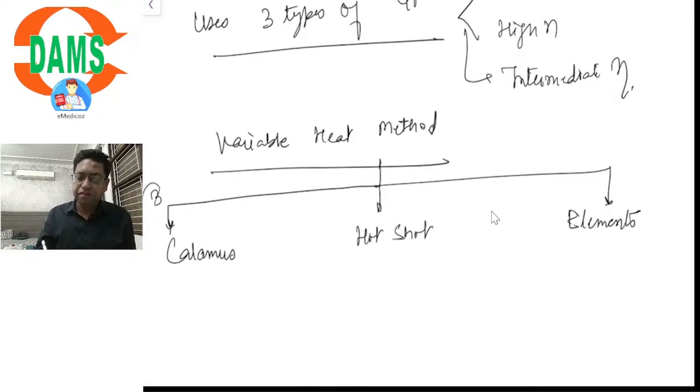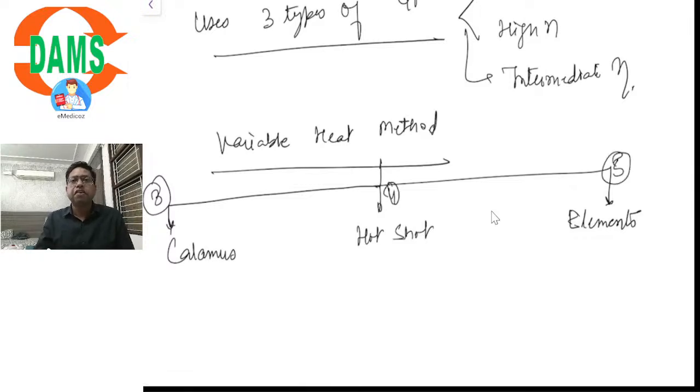That is the third example, the fourth, and the fifth. These are the five commercially available devices for direct injection of liquid gutta-percha inside the root canal. These are called thermoplasticized obturation methods.